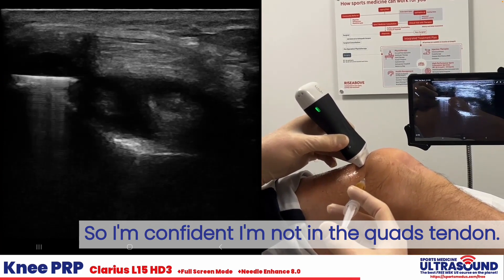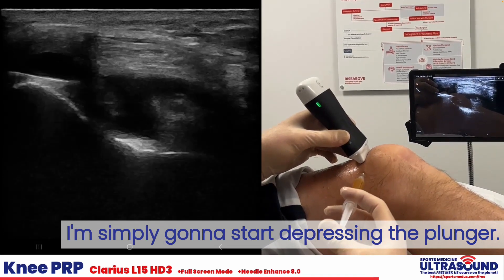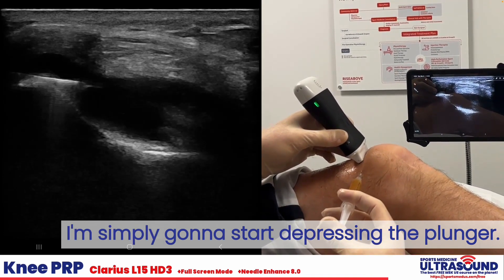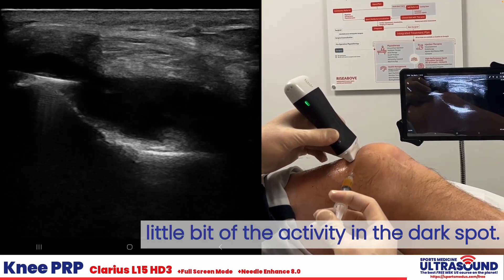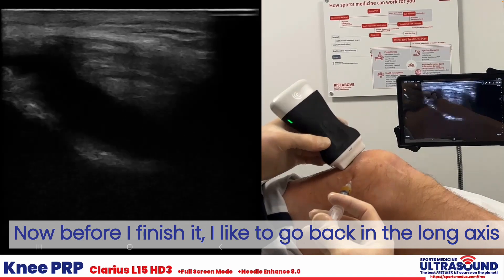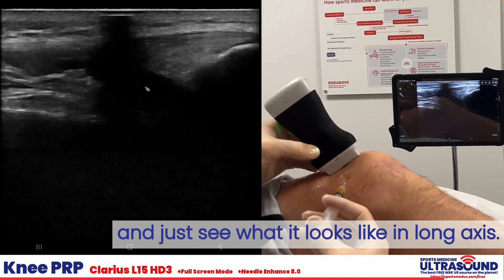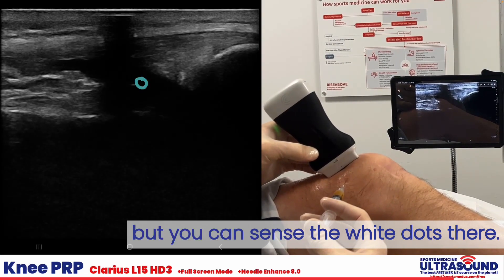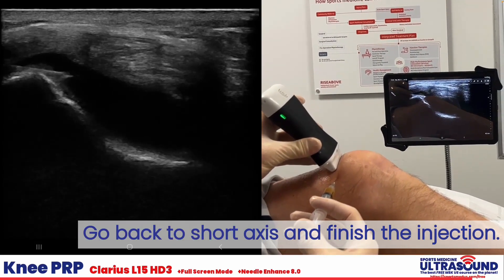I'm confident I'm not in the quads tendon. I'm simply going to start depressing the plunger, getting a little bit of fluid in there. You can see a little bit of the activity in the dark spot. Before I finish, I also like to go back into long axis and just see what it looks like. I'm getting a bit of dropout, but you can sense the white dot there. I'll go back to short axis and finish the injection.